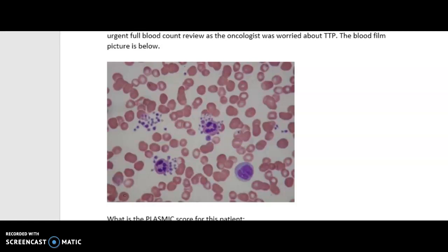So the platelets, due to an EDTA interaction, are going around the neutrophils. And so therefore, they're not going to be going through the impedance count for platelets. Even the other ones are clumps, so they're not going through an impedance count for platelets. And only the ones that are singular are being counted as platelets. So the platelet count is wrong. We do not trust this platelet count. In fact, we would not release this platelet count. We'd probably release that it's clumped, normal, because there is a normal amount of platelets there. If they were to have spread out in their own space, we would have plenty of platelets there.